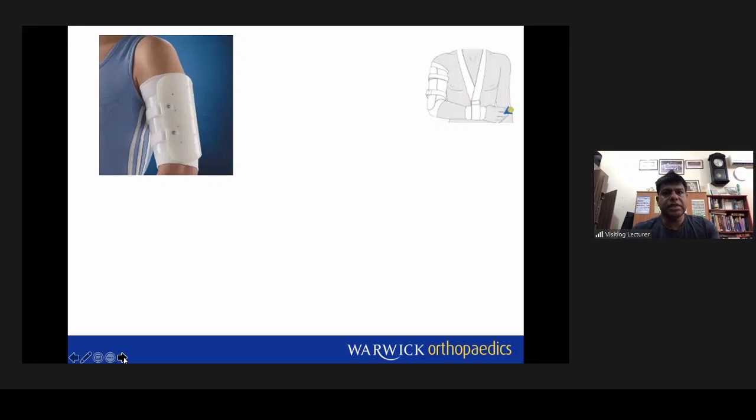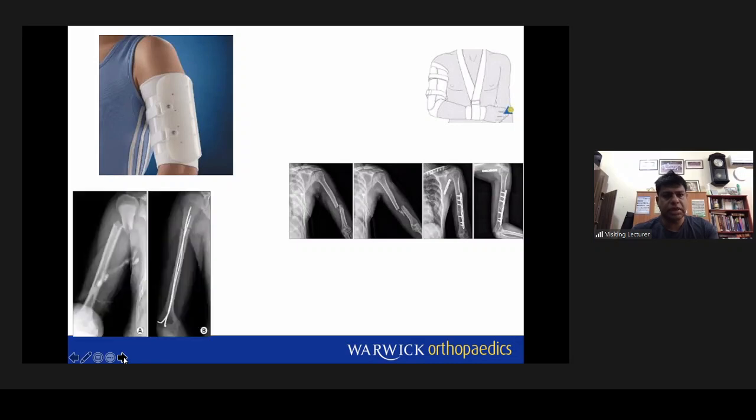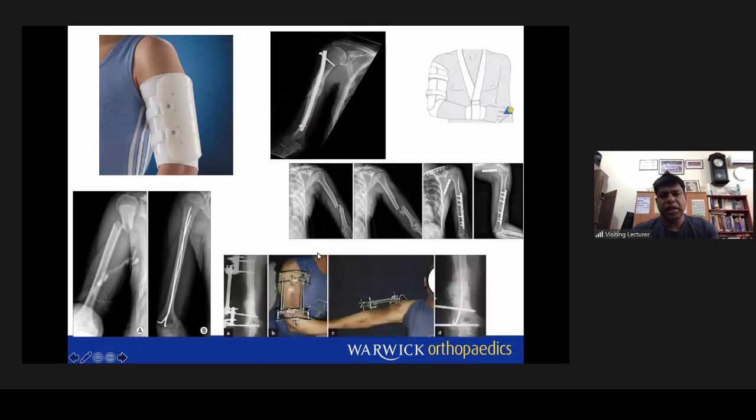So that's a brace. That's the arm sling. That's some examples of internal fixation with plates and screws. And that's some nails. These are old ones, what you call Rush pins. We don't use them. We have proper humeral nails, and that's the proper humeral nail, which is called a locking nail. So there are various ways of managing these fractures. Sometimes if there's a wound, we put an external fixator like that. Yesterday I said when there's a compound fracture, there's a wound associated with it, then you do an external fixation.